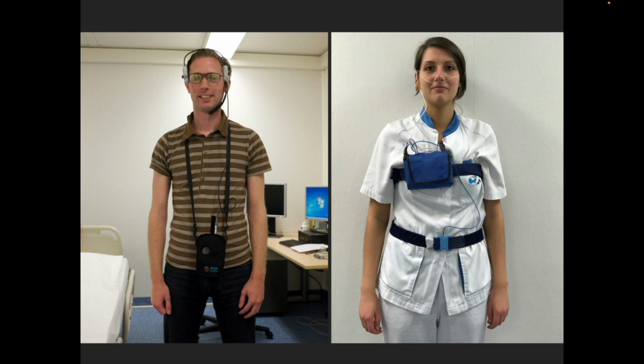The whole system can be easily worn by the patient in a small pouch. On the right side, we see another volunteer wearing a typical setup for the analysis of an obstructive sleep apnea syndrome. And at least to me, the social acceptability of the TCD system might be even higher than the one of the obstructive sleep apnea syndrome setup.